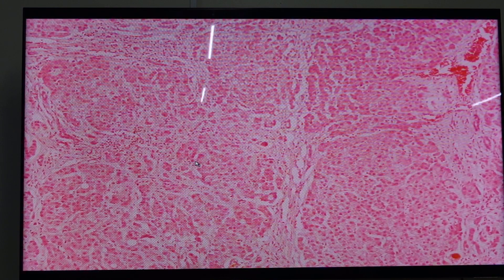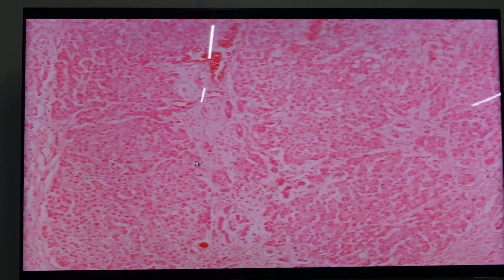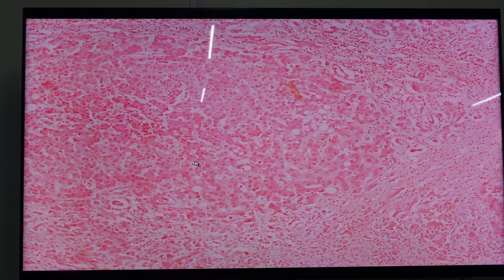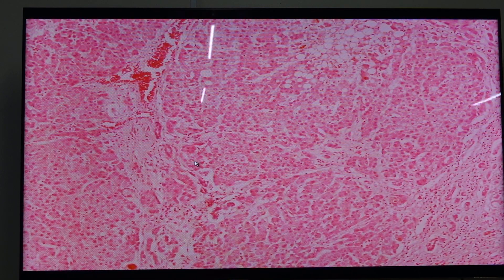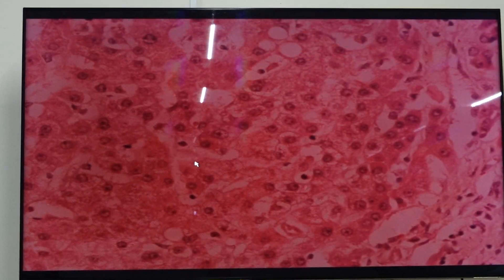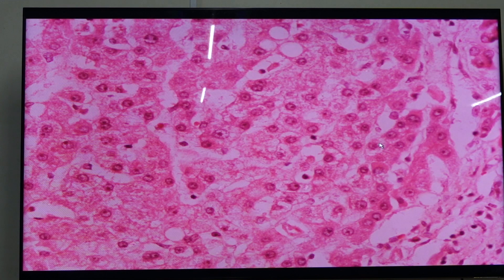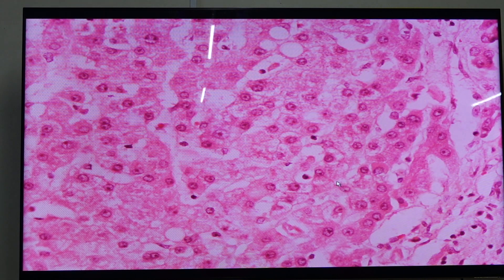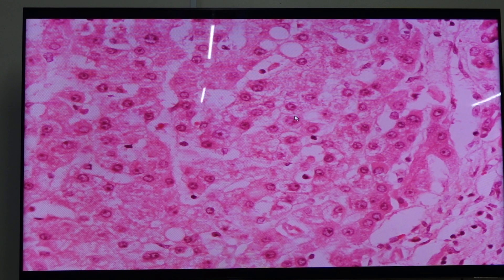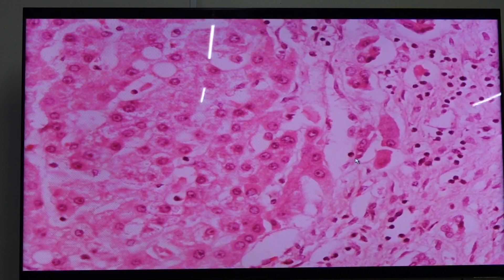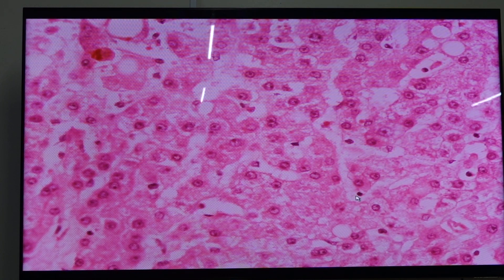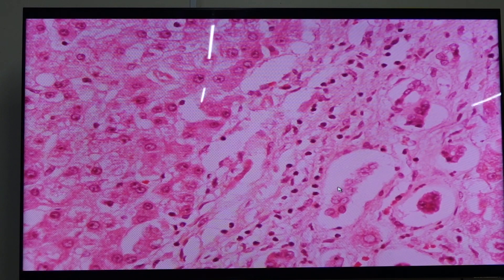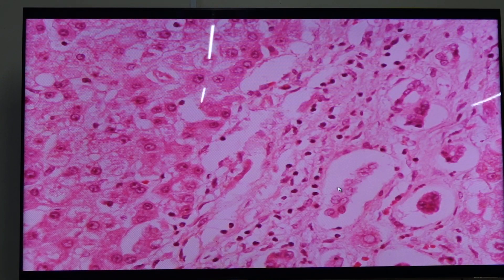The second stage is alcoholic hepatitis. When you say alcoholic hepatitis, there is ballooning degeneration of hepatocytes. Notice the difference in color — the normal hepatocytes have pink cytoplasm, while the ones with fibrillary cytoplasm show ballooning degeneration. We also have the presence of neutrophilic reaction — neutrophils are present in the second stage.